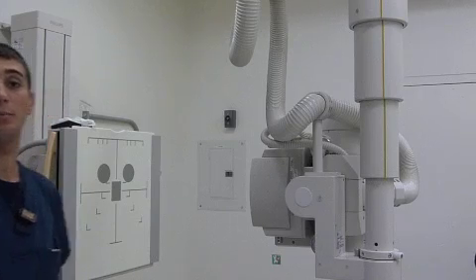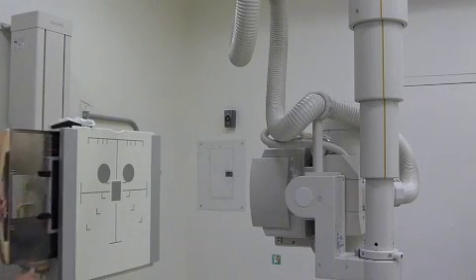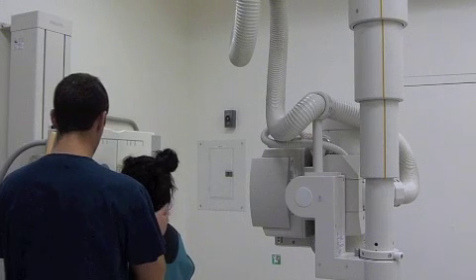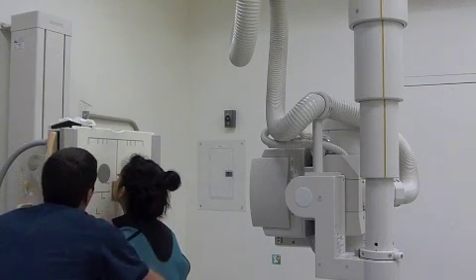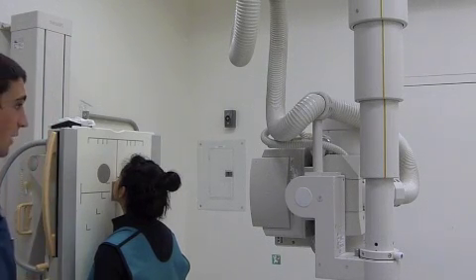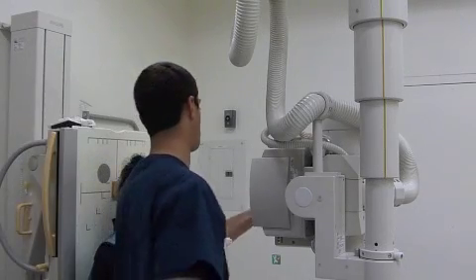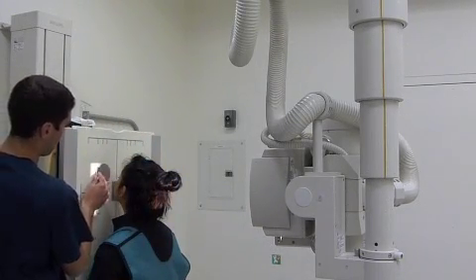I will now be doing the parietoacanthial Waters view with an 8x10 film. And I have my patient come up to the board, and I'm going to have them tilt their head chin up, and I'm having the OML create a 37-degree angle to the IR. I have my tube at 40 inches, perpendicular to the IR. I have my patient shielded. I will now place my marker on the left side of the patient.